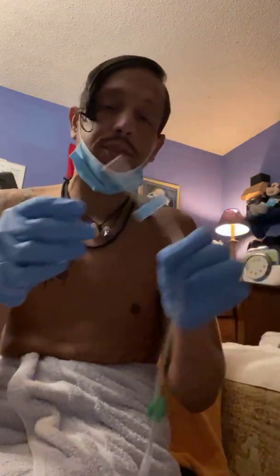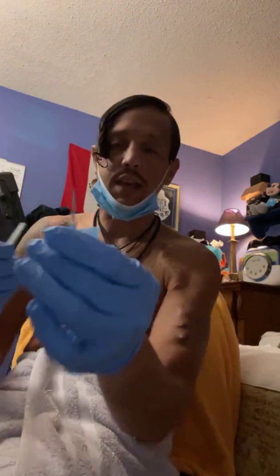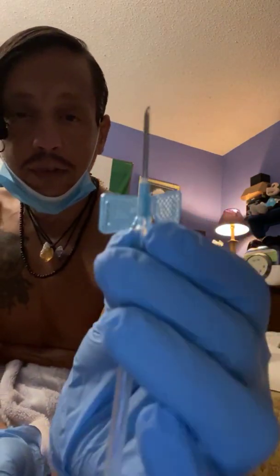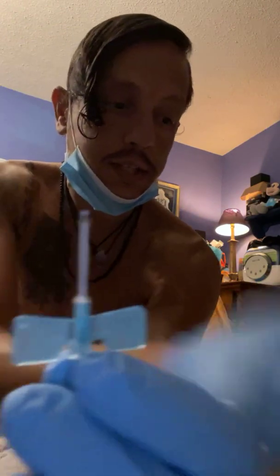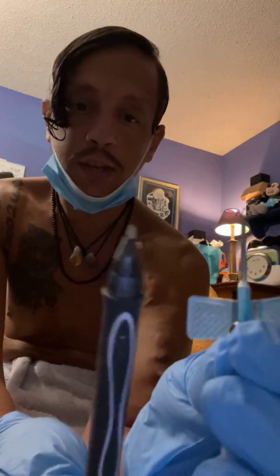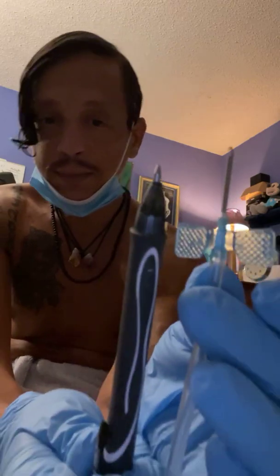So I use 15 gauge needles. I don't know what y'all know about the gauges, but 15 gauge needles are pretty big. They're very big. After 15 gauge is 14 gauge, and the numbers are crazy. So let me just show you the size difference. See this pen? That's the needle, and that's the pen.